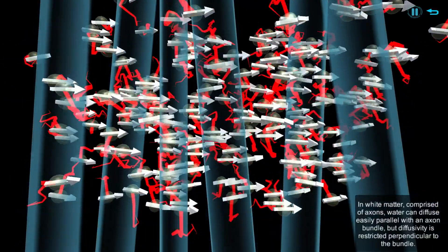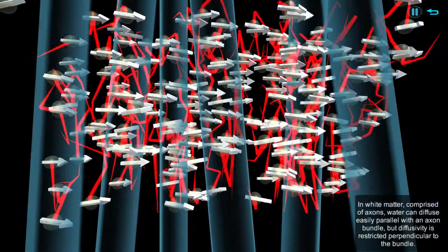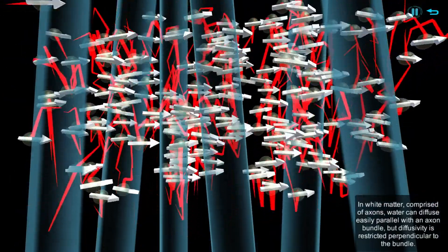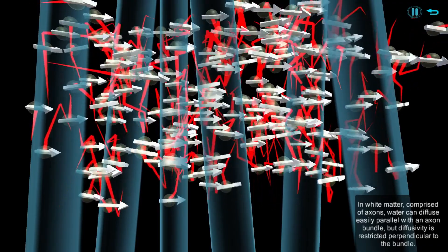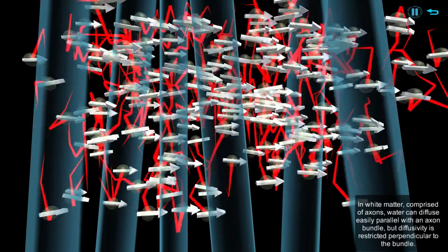In white matter, comprised of axons, water can diffuse easily parallel with an axon bundle, but diffusivity is restricted perpendicular to the bundle.